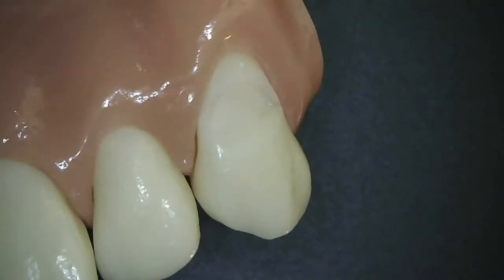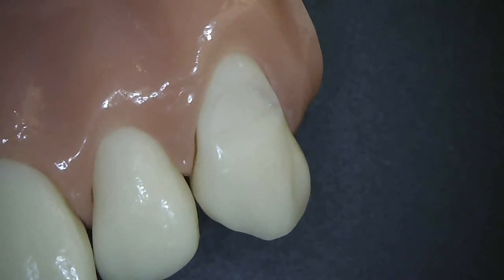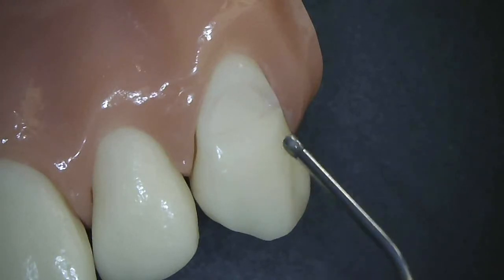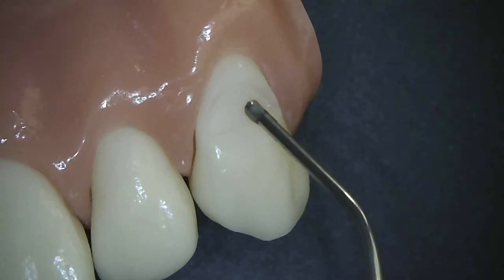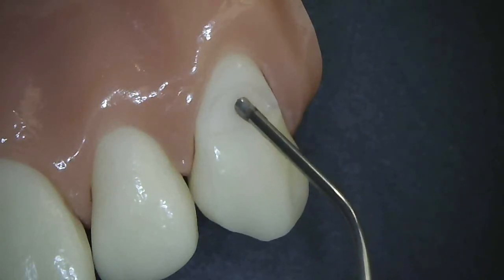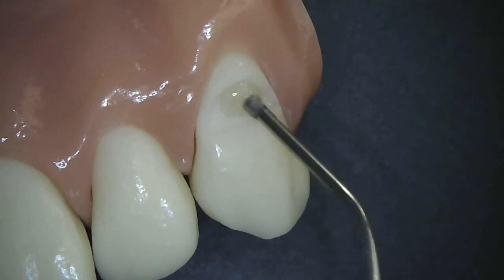Here's a class 5 preparation that's been beveled. I micro etch, acid etch selectively, apply your adhesive — G-Premio bond — and I will typically use only the syringe tip to load in my material like this.